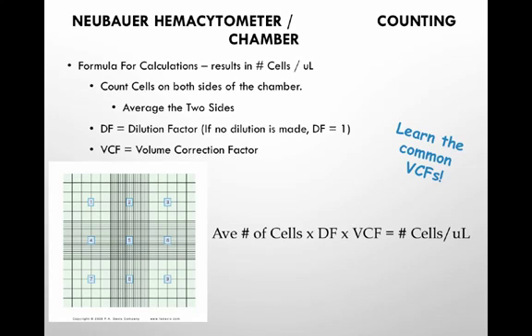For the 5 small squares from that center square, red blood cells is what we're going to be assessing there. The volume correction factor would be, because we're looking at the smaller squares now, 0.2 millimeters times 0.2 millimeters times 0.1 millimeters times 5.